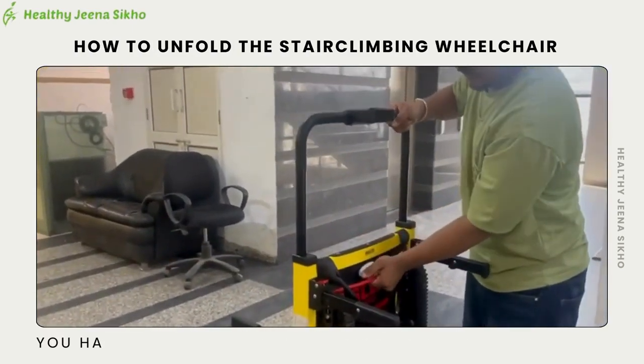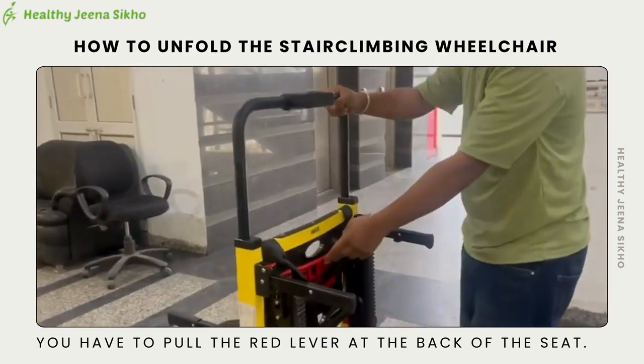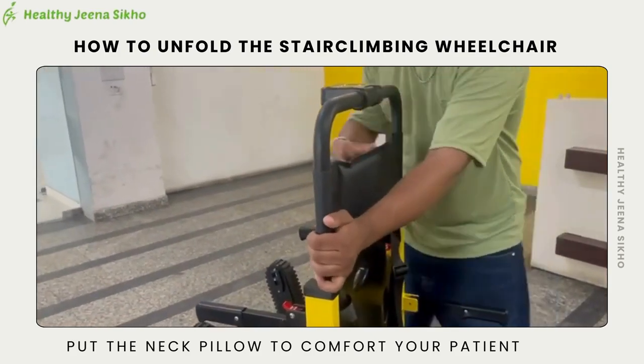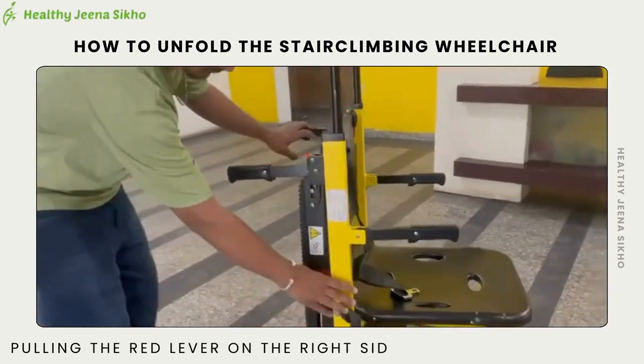To open the neck rest, pull the red lever at the back of the seat and set the neck rest according to your patient's needs. Put the neck rest below to comfort your patient by pulling the red lever on the right side of the wheelchair.